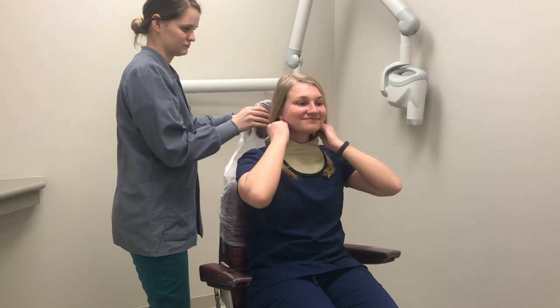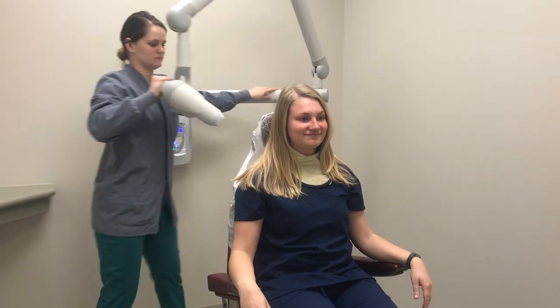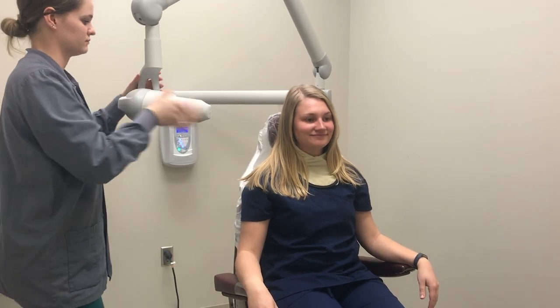Adjust the headrest comfortably. This will help prevent any unwanted movement during an X-ray. Place the X-ray tube head close to the patient to maximize efficiency.